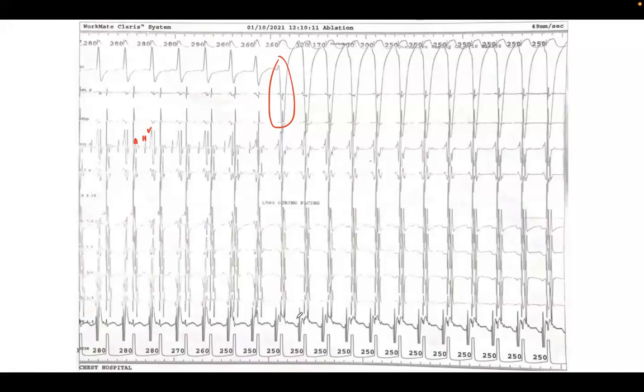Well, we are still pacing. We were pacing at 250. We don't know whether we induced; you have to stop pacing and see what happens. If you stop pacing, the patient will go back to his usual sinus rate. We did not induce anything. We are just pacing fast such that we are manifesting WPW.